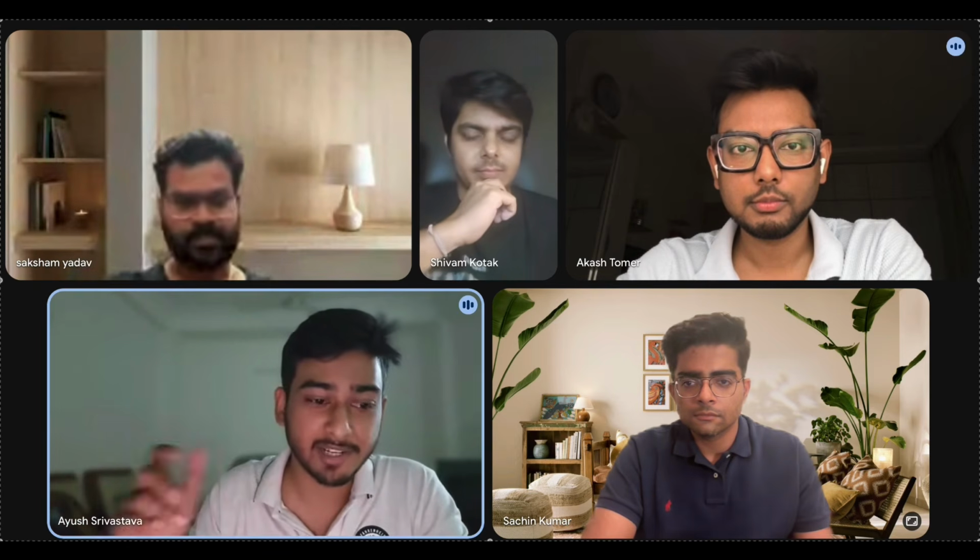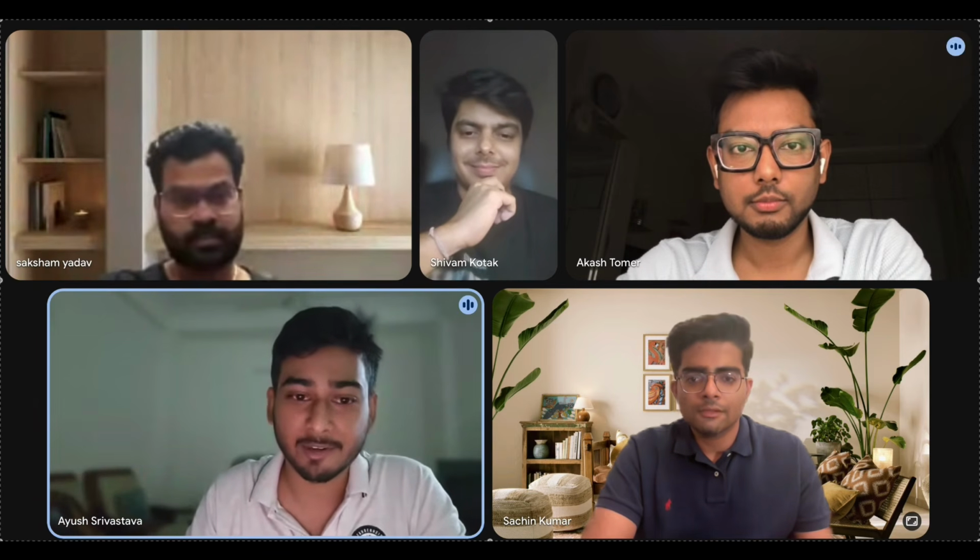It saves a lot of time and it lets me focus on the radiology part rather than the typing part, which used to take a lot of time. I remember when I was a resident, I was a part-time typist for myself and then a part-time radiologist. It was very hectic. It wasn't a good experience at all. So yes, Quillr can definitely revolutionize residency training also, I think.